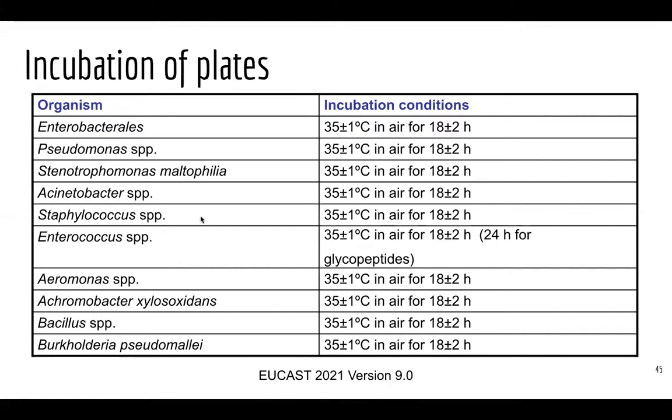And also, with these incubation conditions, you can do it at other temperatures. It will cause abnormalities in the antibiotics. A lot of the antibiotics require a certain amount of stress on the bacteria, and there's no stress if it's a low temperature, or there's certain types of stress depending on the bacterial species. So you might get strange results, but you can do it at a different temperature as long as it's quality controlled by your control strain bacteria that I talked about before with the various characteristics they have.